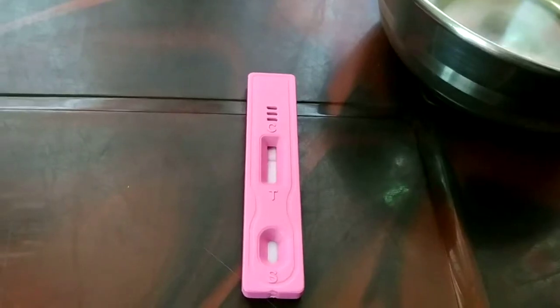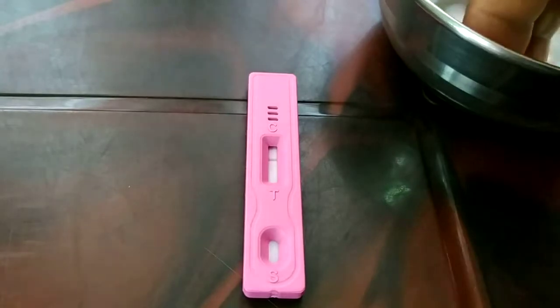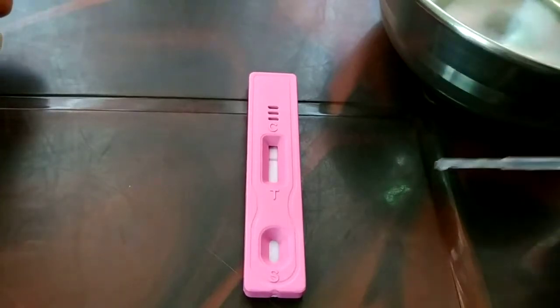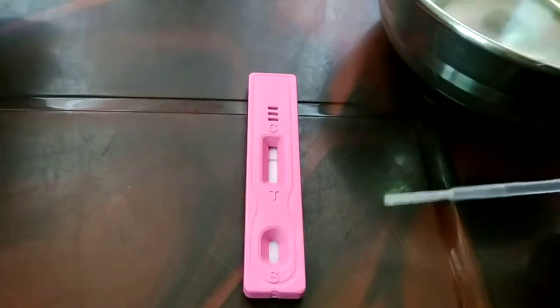You can see the result in 30 seconds to one minute. Sometimes the maximum time mentioned for the result is five to ten minutes, but I got the result in 32 seconds to one minute. You can see right over here on the top there's a dark line.